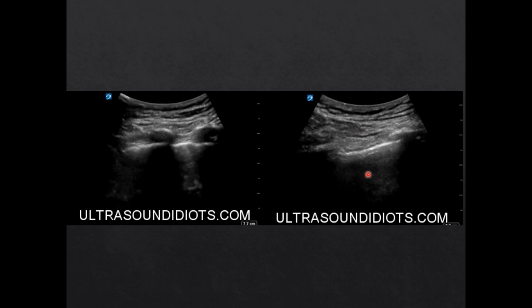And that's really because this is just static. When the ultrasound signal comes down and hits this big pocket of air, the signal scatters. And what you wind up getting, instead of anything being reflected back, is just this mirroring phenomenon. But this line is the main thing you're looking for. There is no movement in the pleural line. Now, it's important to note that this lack of movement, this lack of lung sliding as it is called, does not allow us to say, aha, this is definitely a pneumothorax.